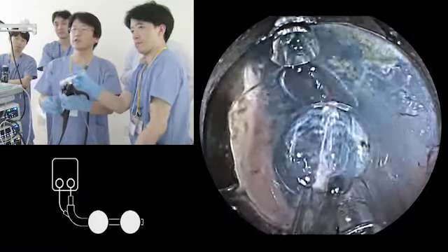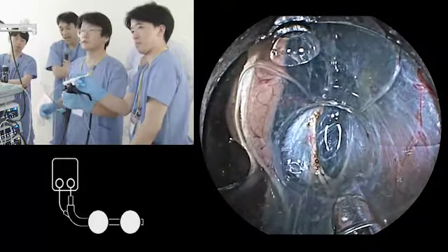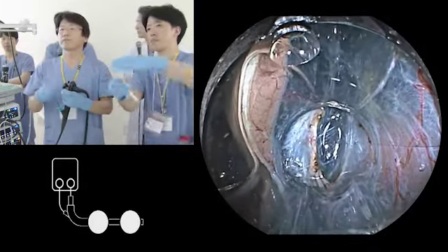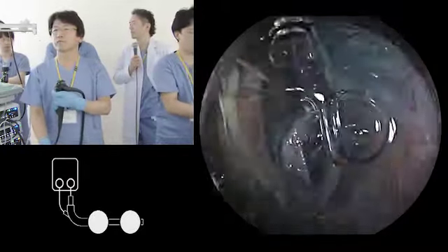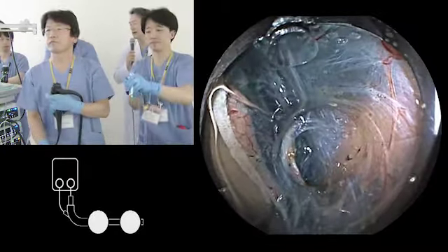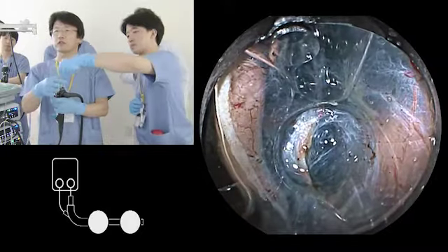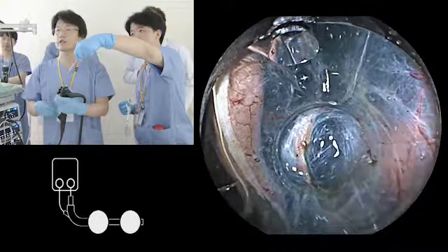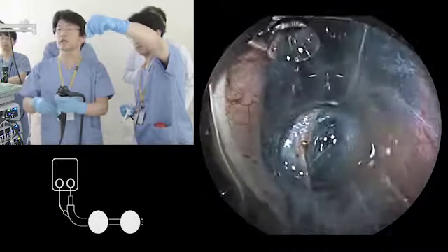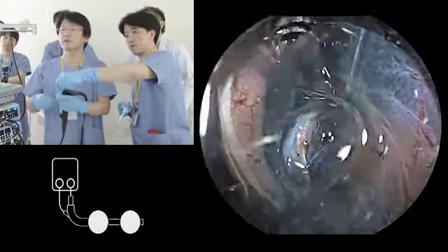It's similar to the Splash needle, do you see? I don't see the tip. Actually, I find out the length of the tip from the black line. So just by seeing the sheath, you can guess the location of the tip of the knife.